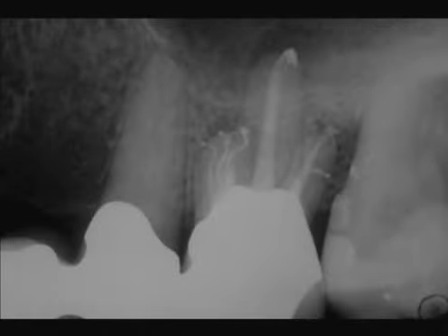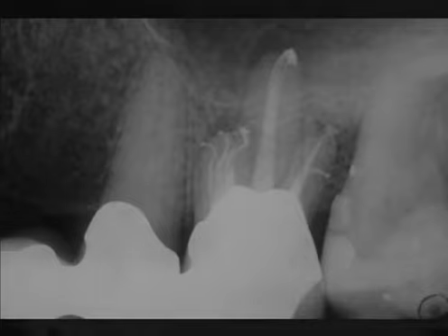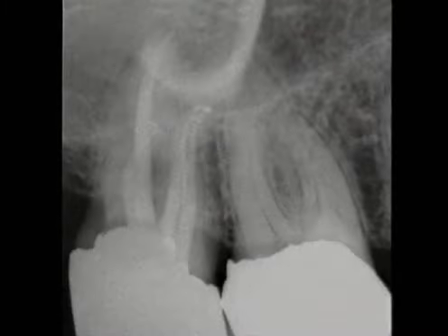Some maxillary molars can exhibit bizarre anatomy within the MB root. The grooves need to be explored for the possibility of a third system. Access cavities need to be fully expanded, so we have the possibility to identify, in this particular case, DB1s and 2s, MB1s and 2s with a long anastomosing, and there's two palatal systems. Even the maxillary second molar should be expected to have two systems in the MB root until proven otherwise.